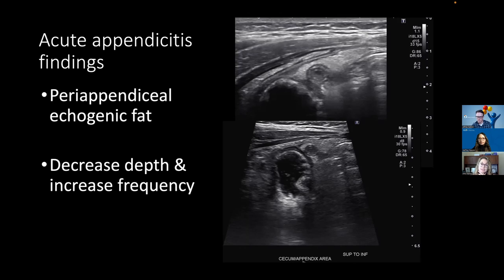We save cines. Okay. So I love cines. My IT guys probably hate me because we take up so much space with all of our huge ultrasound studies, but I find that there's so much problem solving you can do on cines after the fact. Especially on busy days when you don't have time to get up and scan, the cines save you from having to go back and scan a lot.